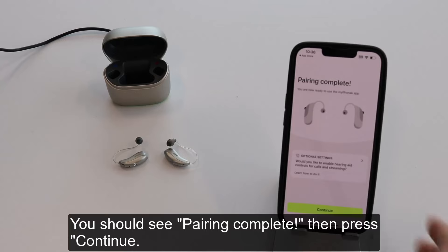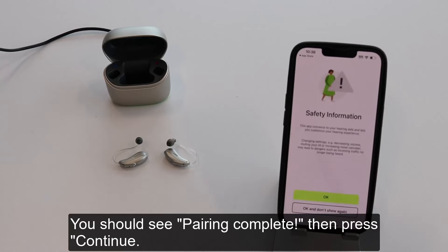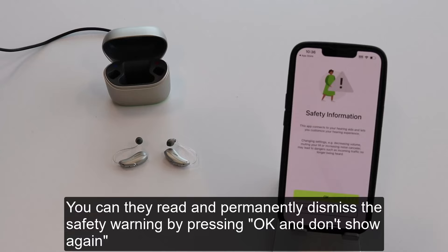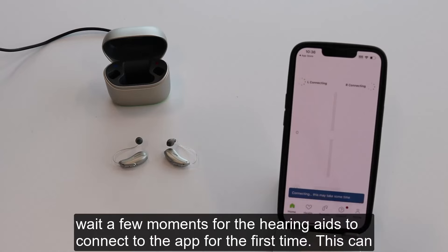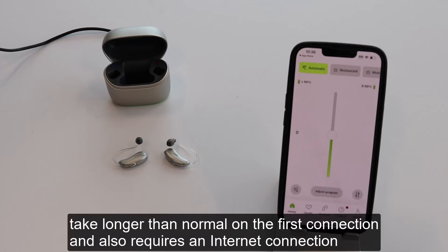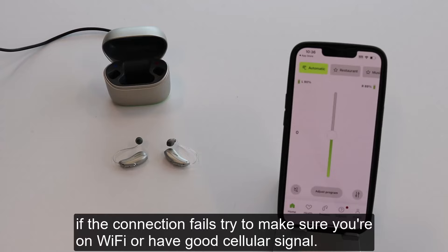You should see pairing complete, then press continue. You can then read and permanently dismiss the safety warning by pressing OK and don't show again. Wait a few moments for the hearing aids to connect to the app for the first time — this can take longer than normal on the first connection and also requires an internet connection. If the connection fails, try to make sure you are on Wi-Fi or have good cellular signal.